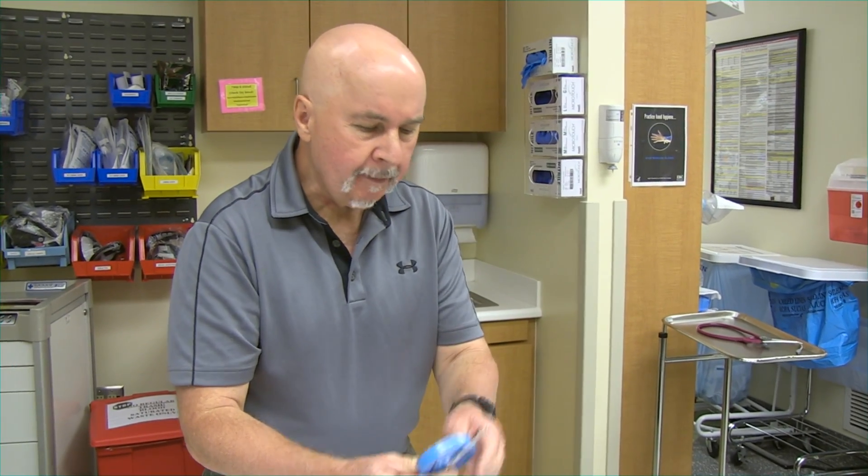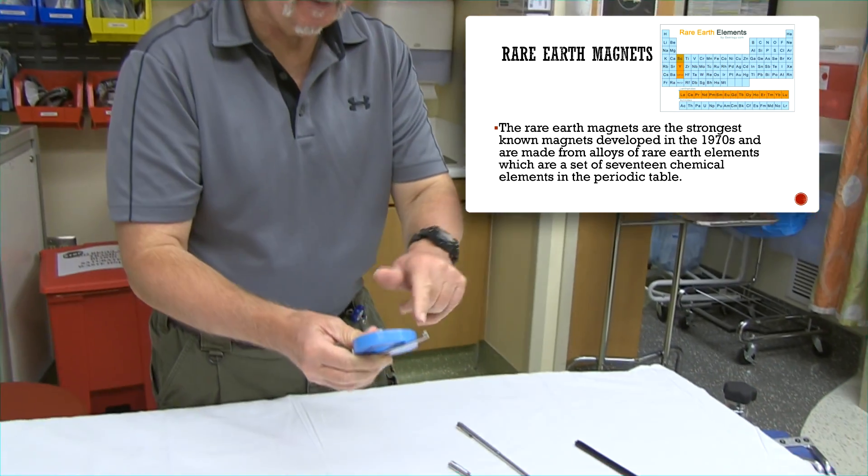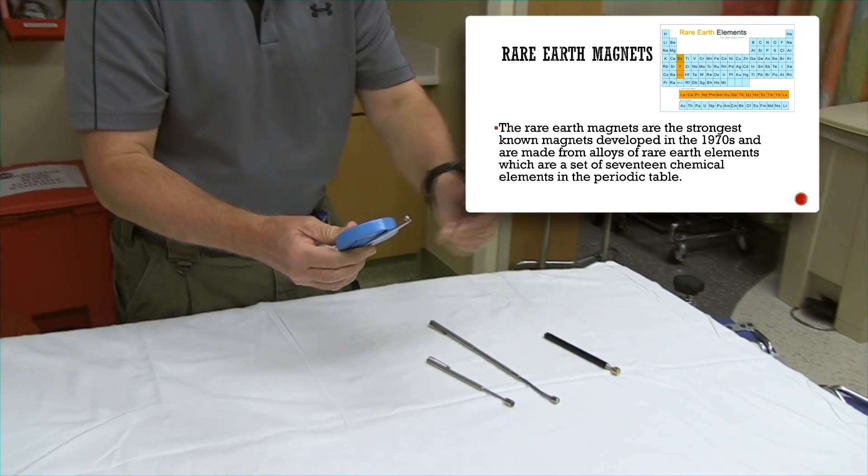It's not as strong as one of these rare earth magnets. This is a rare earth magnet too, but this one is kind of secondarily magnetized.